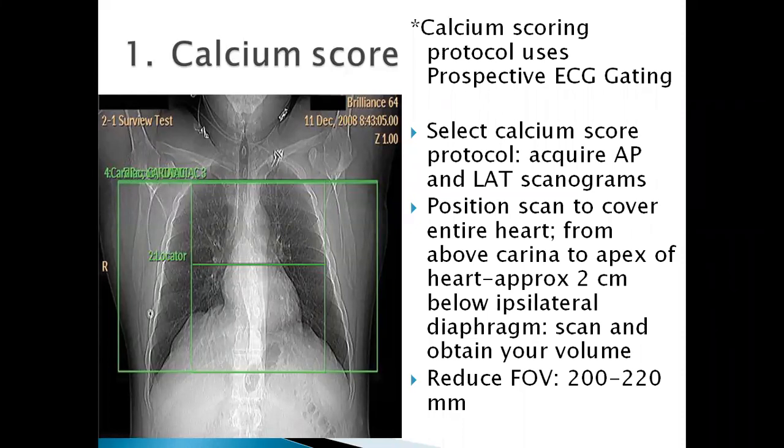So why is this important? It means that it's actually possible for certain patients that have a high risk of coronary artery disease to be screened for the level or presence of calcium in their coronary arteries. It can be used as a mode of screening. And then let's get to how we can do it now.